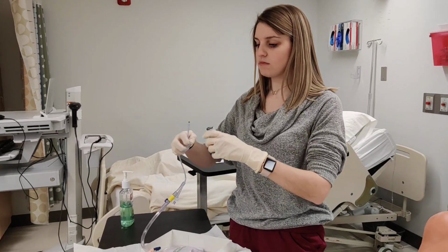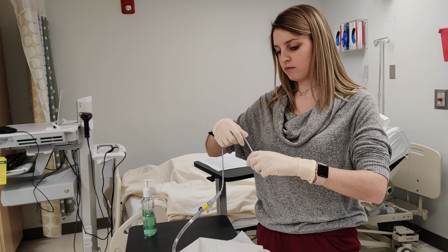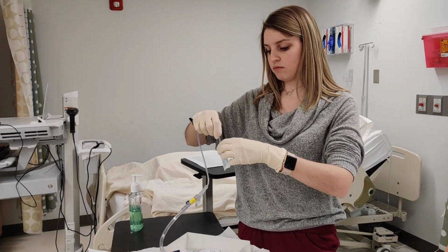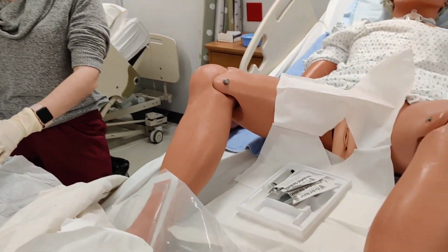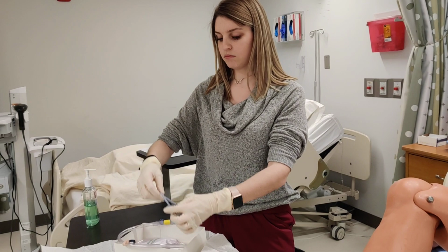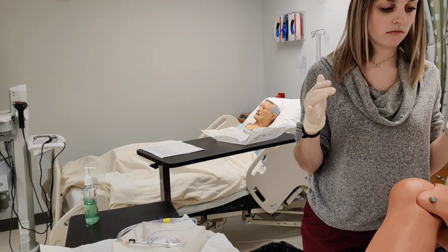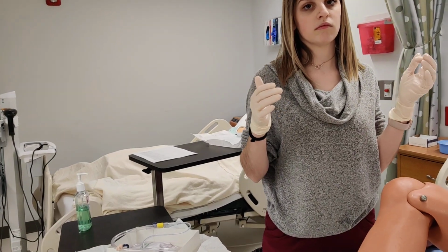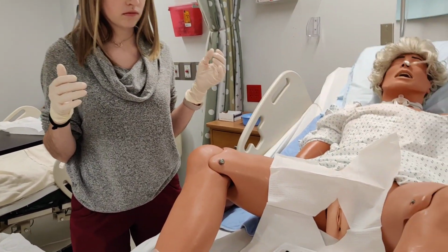So once she has that catheter out, she's coiled it in her hand and she's sticking it right in the lubricant packet. Another way that you could do that is to squirt the lubricant out into this plastic tray that it came in and run the catheter through it. For lubricating purposes, it's ideal to have the entire length of the catheter lubricated, especially for a male patient.